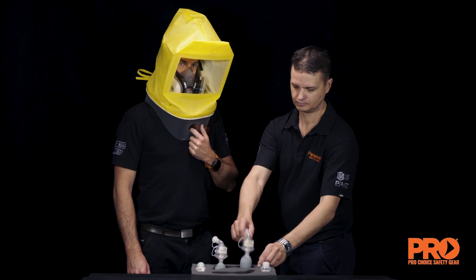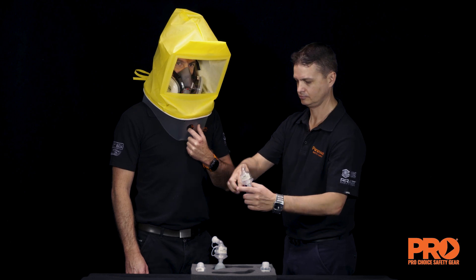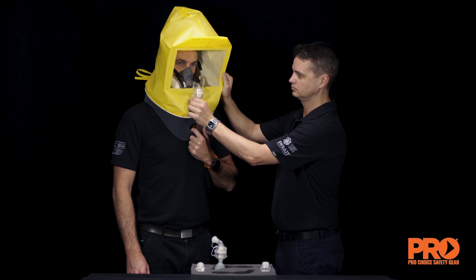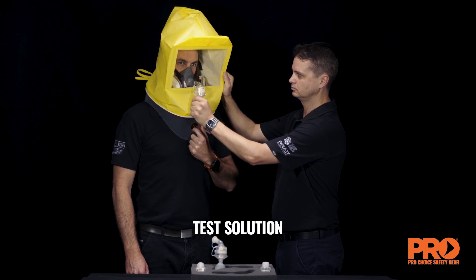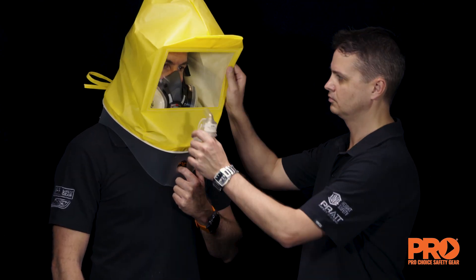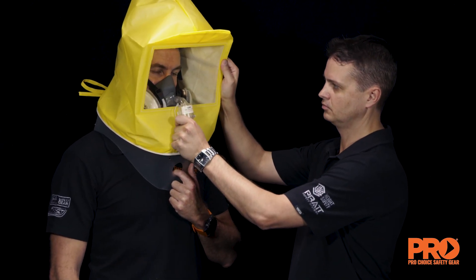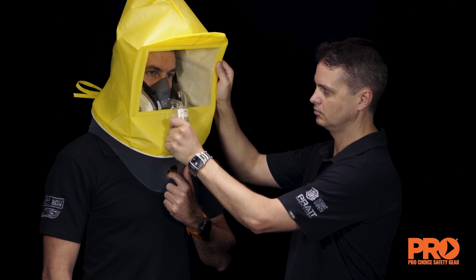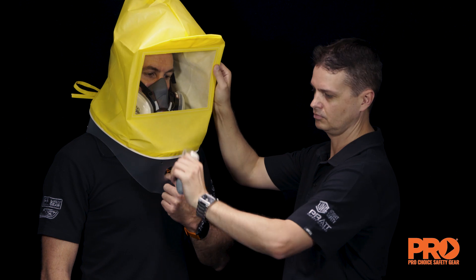Fit test. Have the test subject don the respirator and perform a fit check. Have the subject put on and position the test hood as done with the sensitivity test, and breathe through their mouth with tongue extended. Using nebuliser number two with fit test solution two, inject 10 squeezes, fully collapsing and allowing the bulb to expand fully on each squeeze.